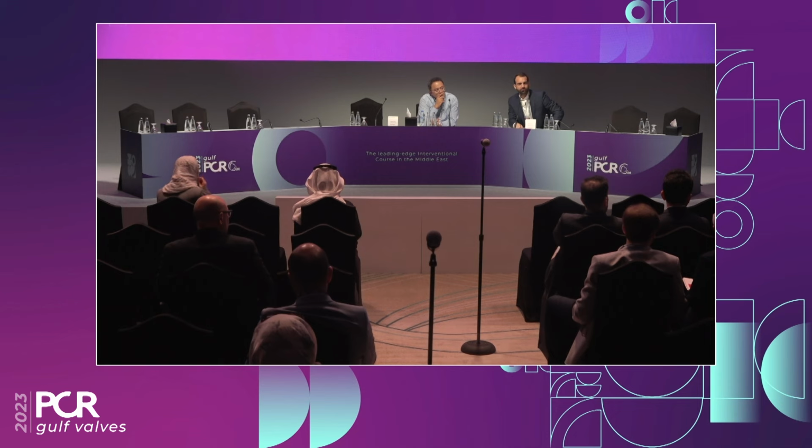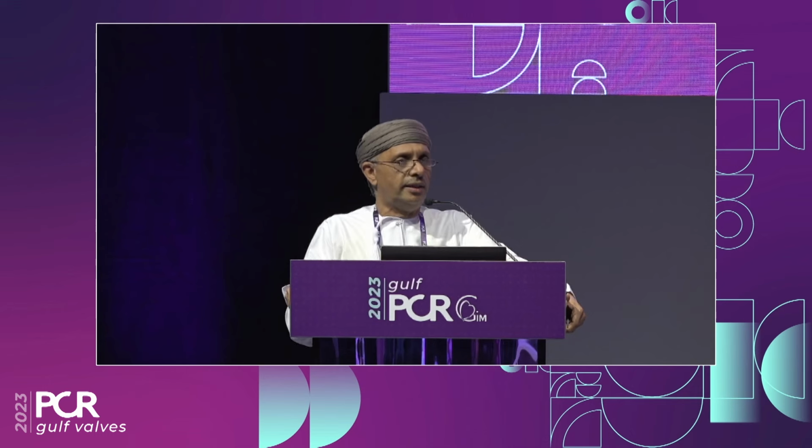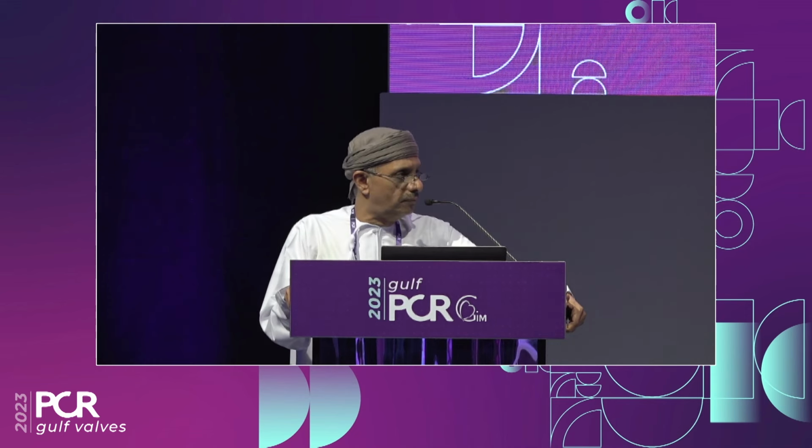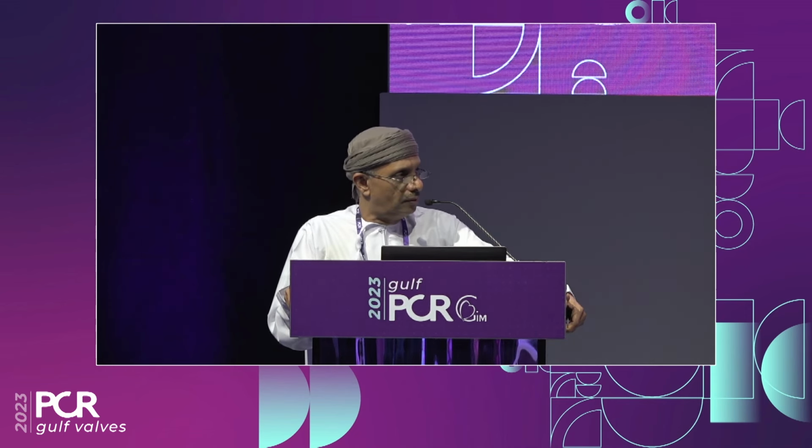Balloon expandable. Okay. Anyone have used the loop snare technique when they have difficulty getting the valve in the patient with the horizontal aorta? Yeah, and especially if bicuspid, sometimes you cannot cross. Yeah. I didn't do it from the get-go. I had to remove the whole system and then reintroduce a snare. Okay. There's a Chinese series of 100 patients. They did snare on everybody who is bicuspid and horizontal from the get-go. So this is something you can do in cases where you think you're not going to cross. Or balloon sliding, or balloon, what you call it? Yeah, that's old fashioned.